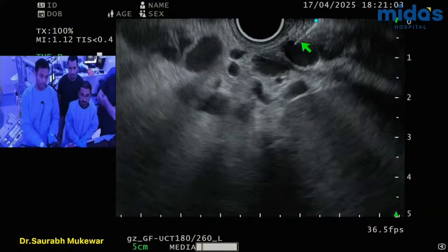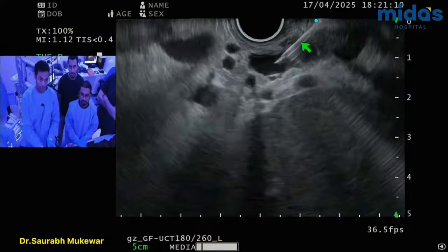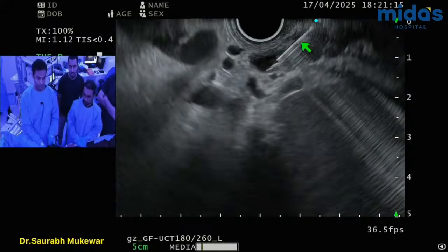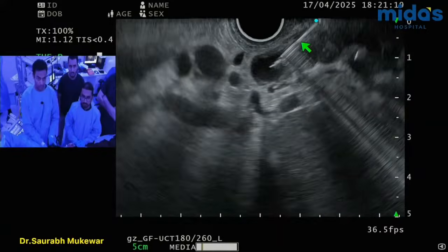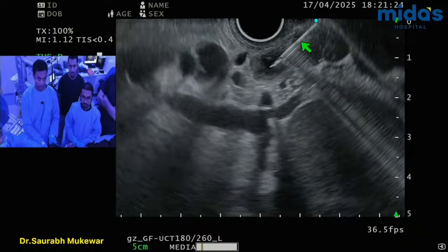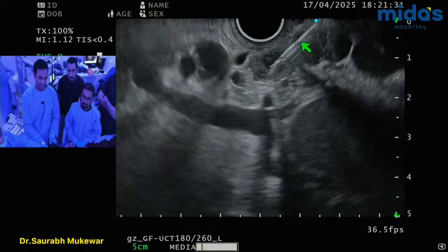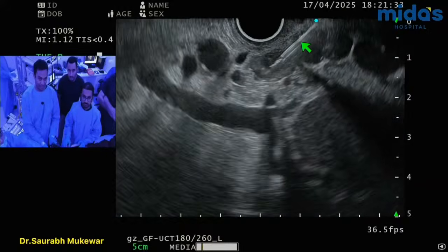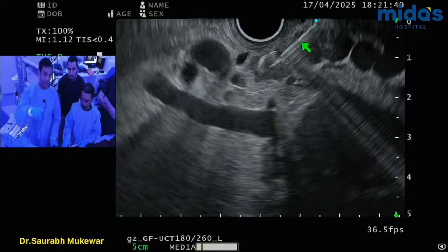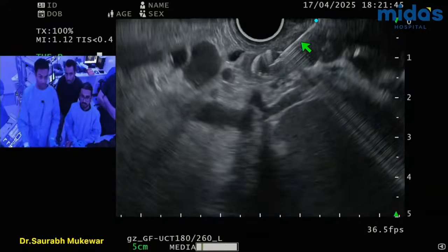Ooh, I'm in. All right, sorry, I'm in. Yep, we are in. Right, so that's the location. That's the feeder. Nice, perfect. Go ahead, put the coil. Oh, I missed the flow in the varix before. Should have done that quickly. Yep, okay, that's lovely. Very nice. Okay, that's great. Now you see, as soon as we did that, there's activity, bubbles in the varix. You see that? So she'll put some NS now to show you.